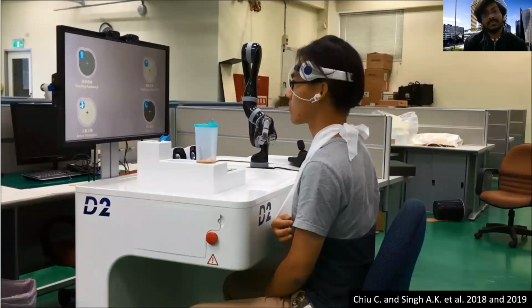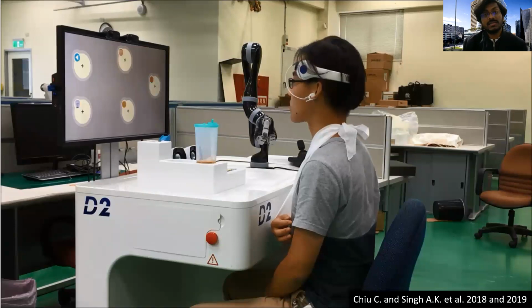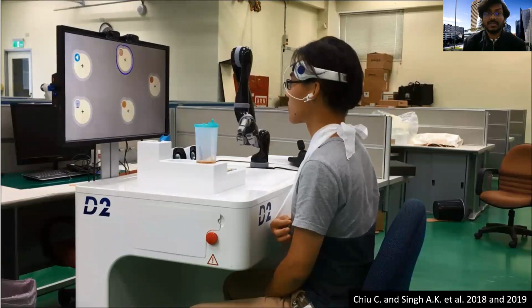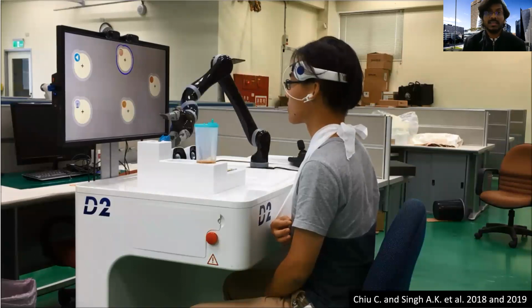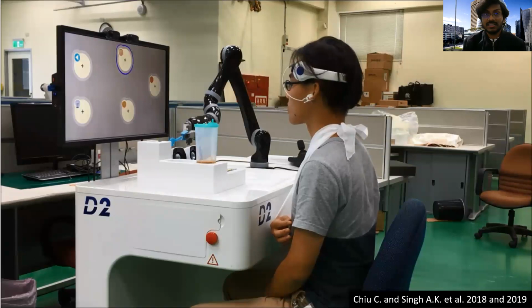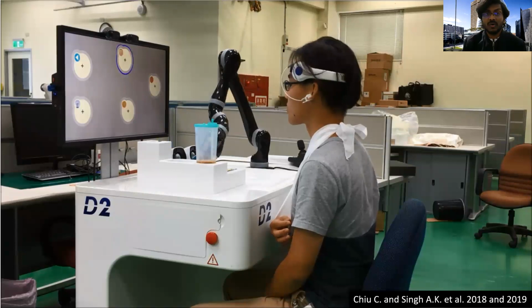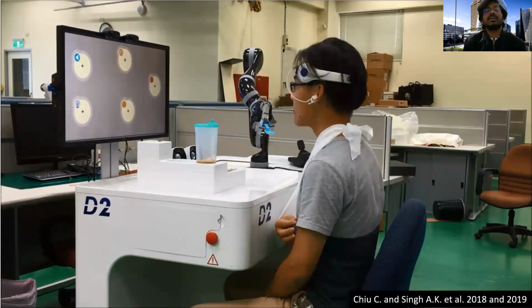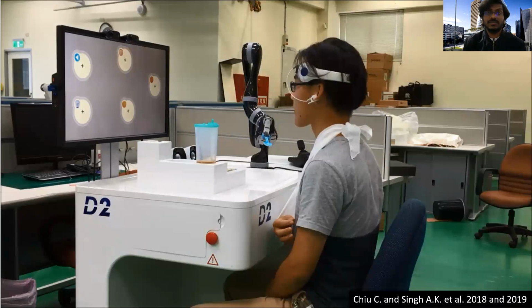You are seeing here that the participant needs to see different options. He can focus on the required option he's interested in. In this case, he's looking at 5 options, and all 5 options show him different food choices, including the water and a going back button. He has chosen a certain food choice. You can see it selected in blue color, and the robot arm gets a command, takes the food and feeds the user. That's a nice demonstration of a brain-computer interface, of what is possible with the SSVEP paradigm.